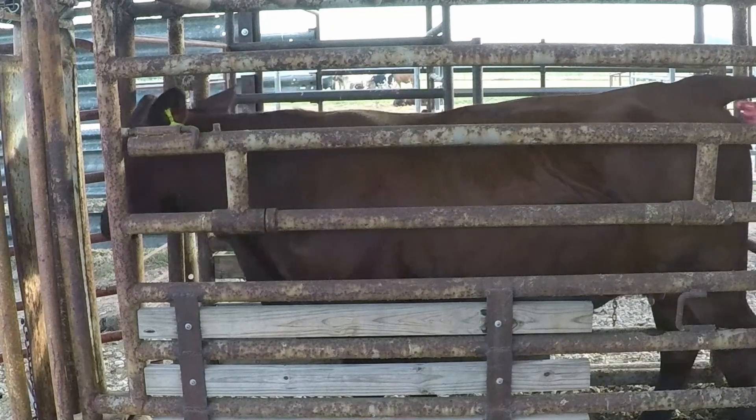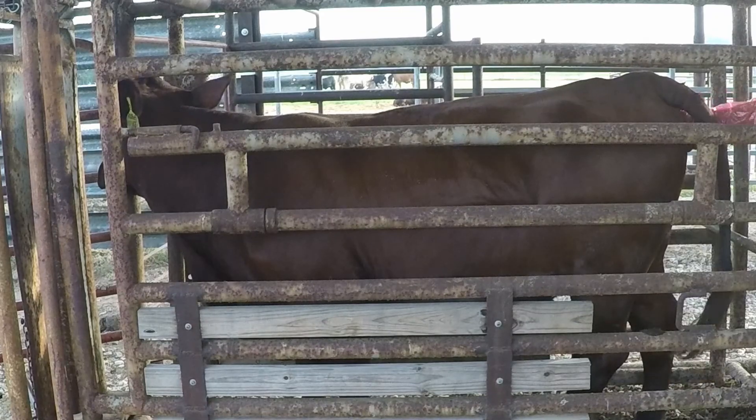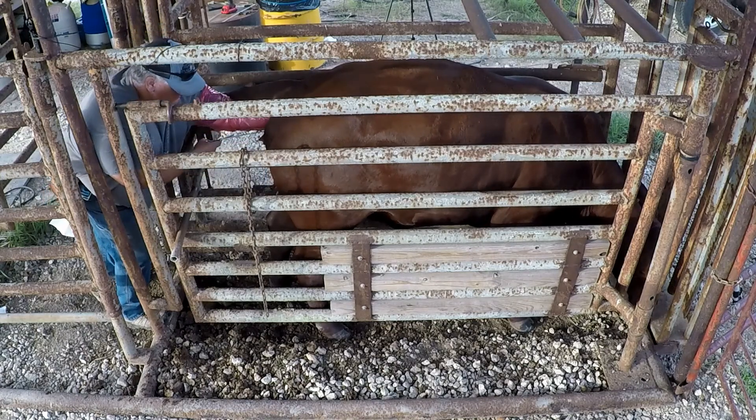Here we go. This is a Sennigertrudis. Actually, I think this is an AI baby from a couple years back.